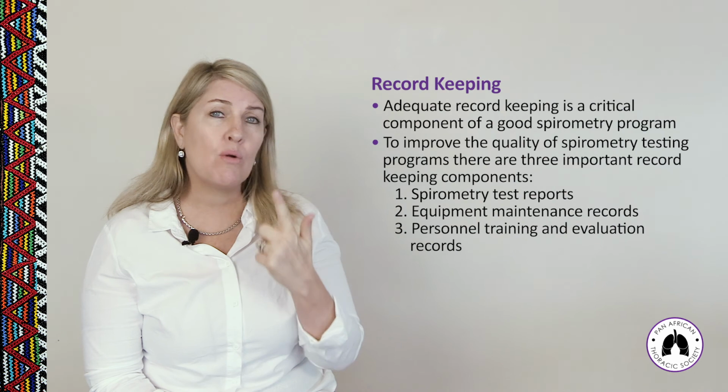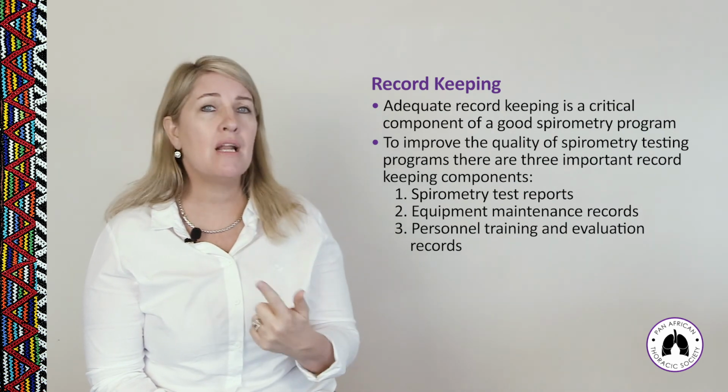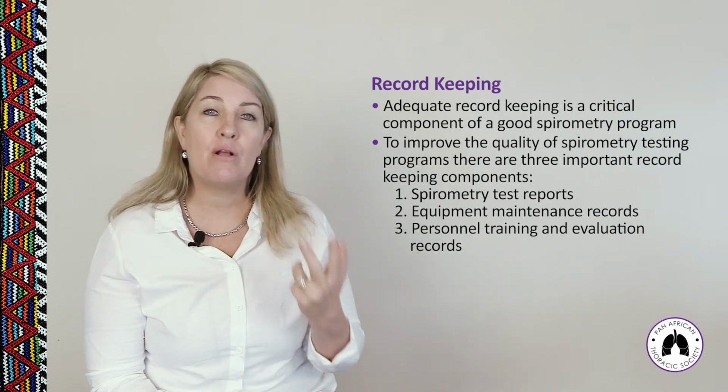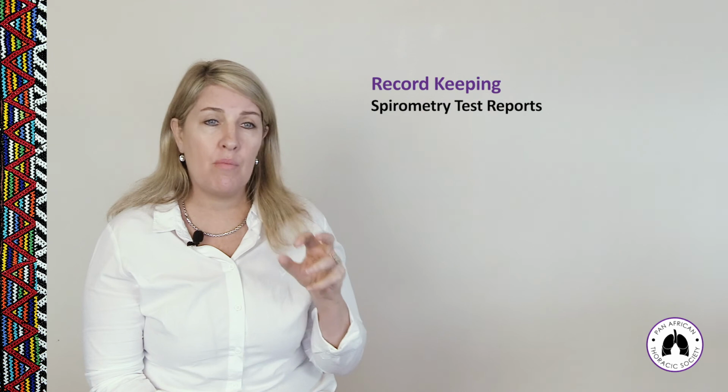Secondly, keeping records of your equipment maintenance, and that would include calibration and biological calibration test reports. And then lastly, keeping records of the personnel training and evaluation records. So let's look a little bit deeper at spirometry test reports.